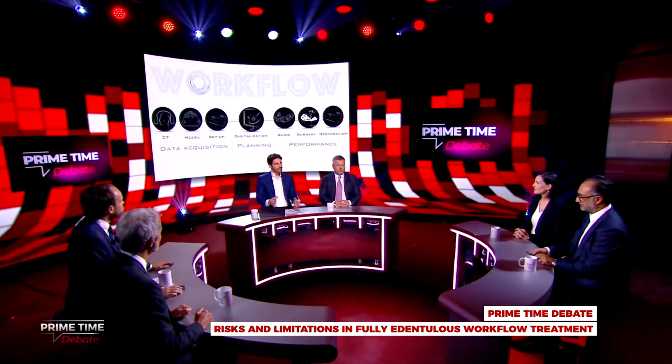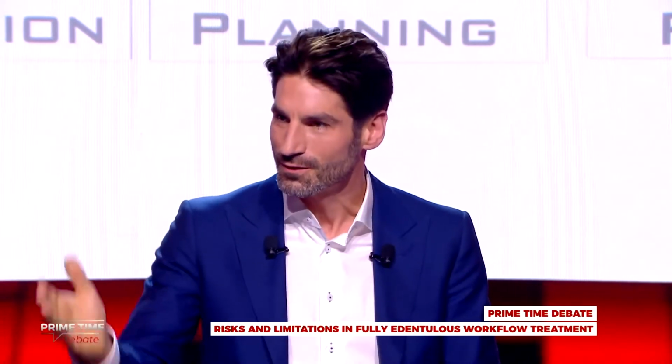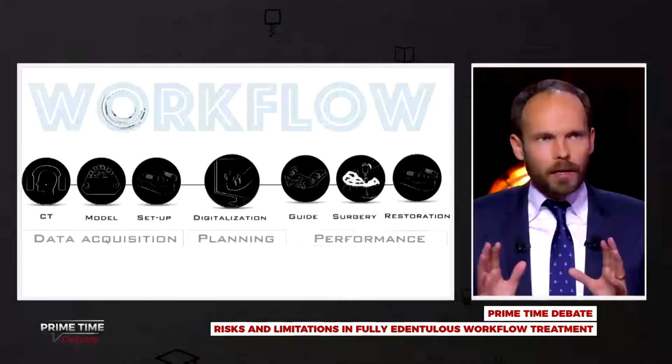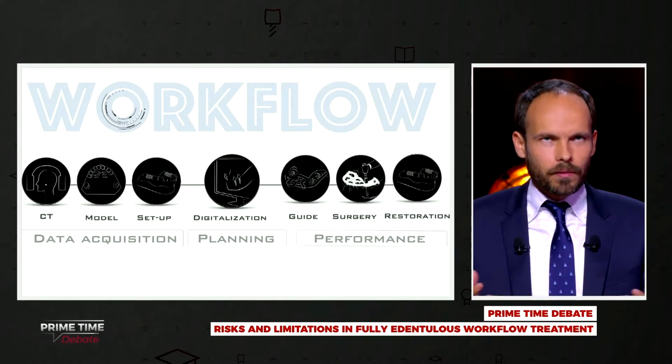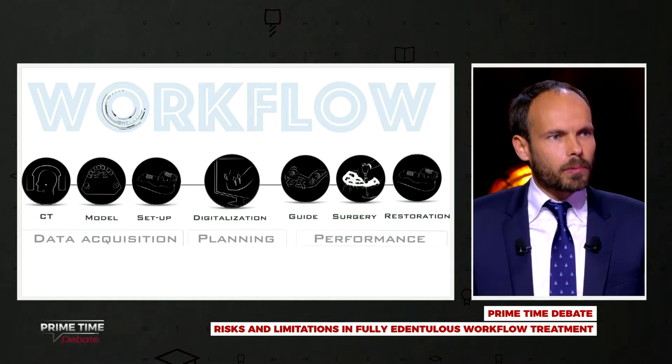So I understand you prepare and then you have the dental technician ready. You start working on the prosthesis and everything else, and then the last day you use it as a reference point. You get that data, and then within 2 weeks we go in. So this requires quite some team coordination, I think, Vincent, with your experience. But you see, this is different from the partial edentulous or single crowns that we had on the first day. These full arch cases, the team has to be set up and prepared in a completely different way than for day-to-day cases.